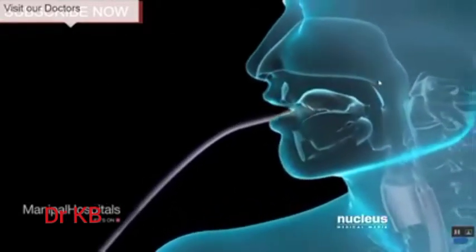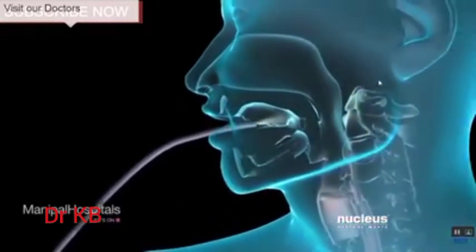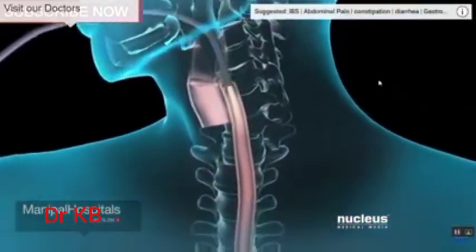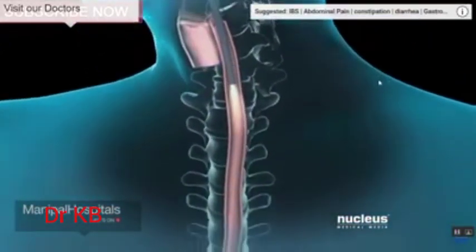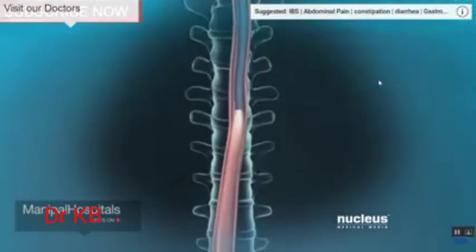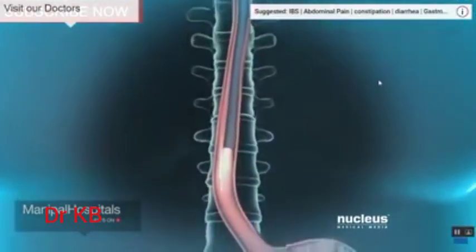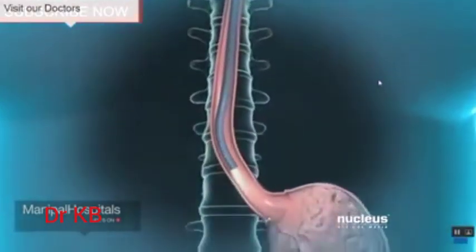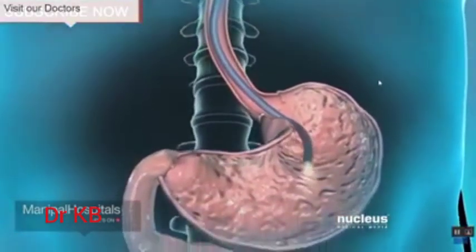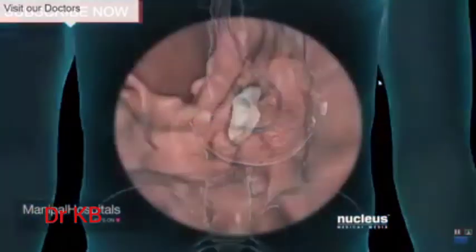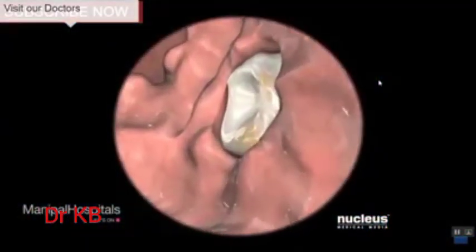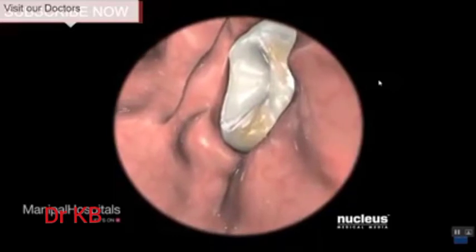Uncomplicated upper endoscopies take between 10 and 20 minutes. Your doctor will gently insert the endoscope through your mouth and then slowly and carefully move it down your esophagus until it reaches your stomach, and finally, your duodenum. You should feel no pain as this is happening.